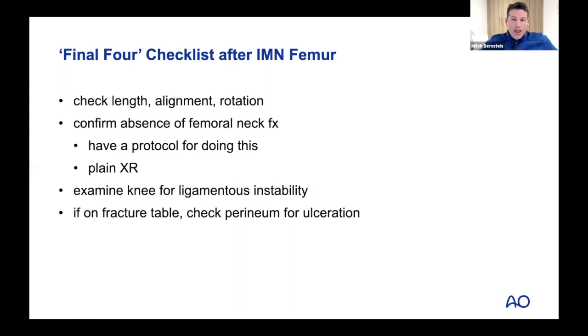But I like to do that sterile. You're in the OR, you're not emotionally done with the case yet, and you're still ready to adjust it, or even before the interlocks go in. I had a case where the nail went down the wrong path, took the plain film, and then just took the nail back out and realigned it.